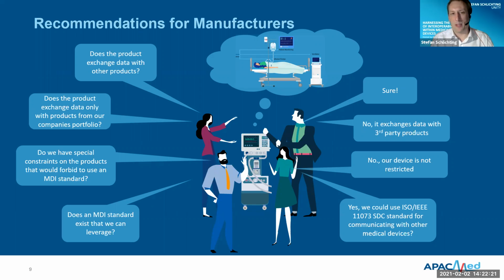So for manufacturers, we give a recommendation path, some kind of decision criteria that they should look at and really think about: wouldn't it be beneficial if we integrate an interface into our products that uses interoperable standards? And wouldn't this address the need, for example, of the hospitals later on, so that they can build up their scenarios from multiple manufacturers and have in the end the best clinical support for their patients?